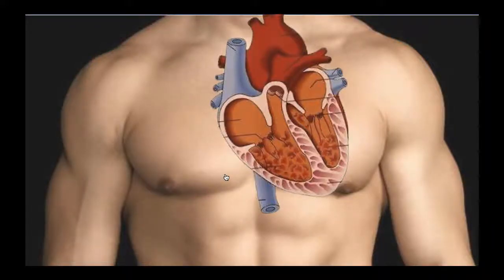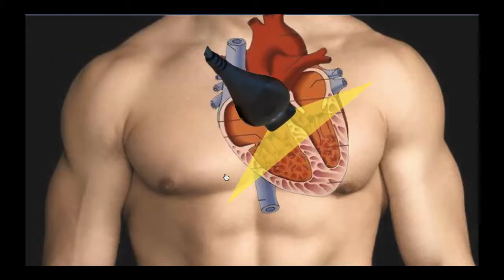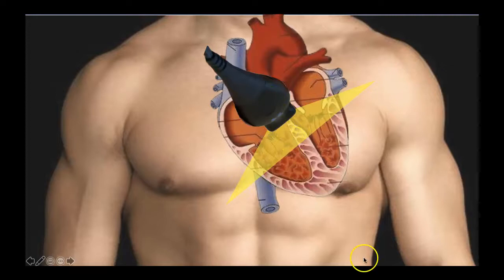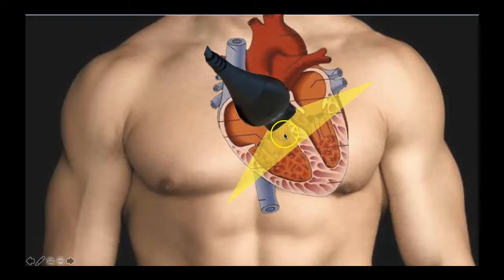Now to get your next view — the parasternal short axis — you're going to start with that long axis position and then flip your probe 90 degrees. Whereas you had it to the left of the sternum with the probe marker facing the patient's left hip, now you turn 90 degrees and your probe marker faces the patient's right hip. That was long axis cutting through all the chambers; now this is short axis, just getting a cross-section of the heart.